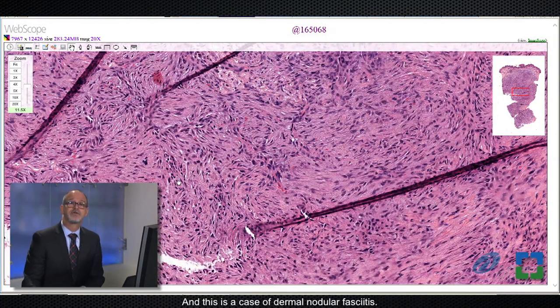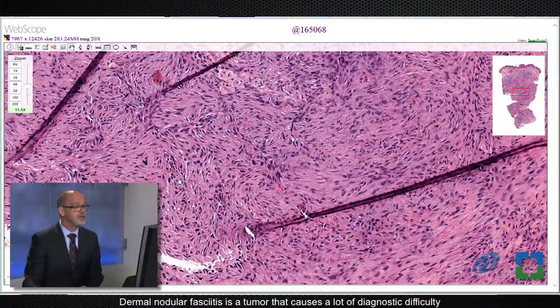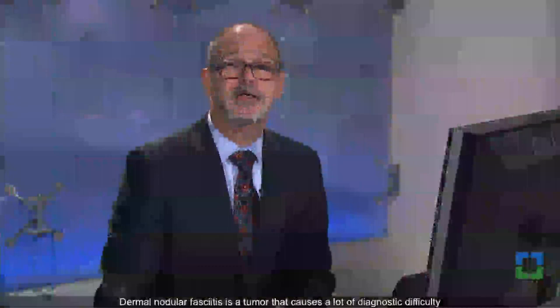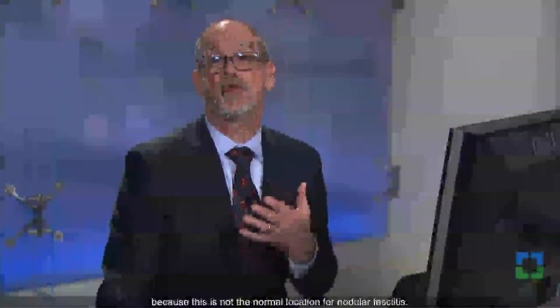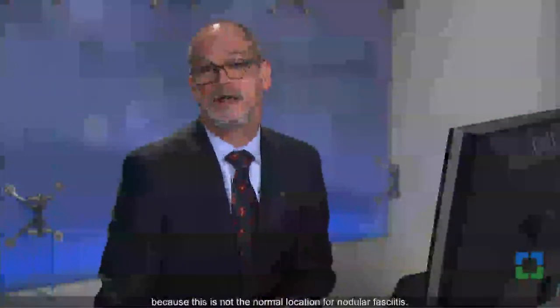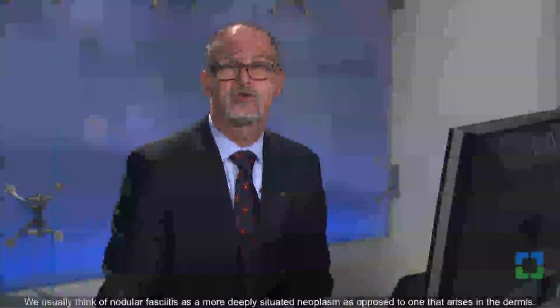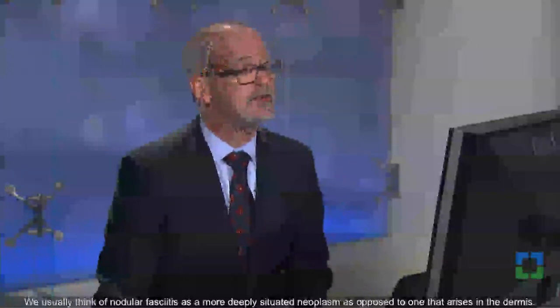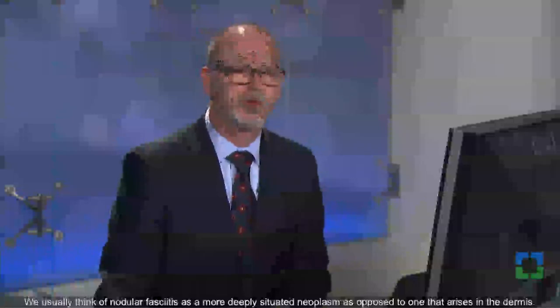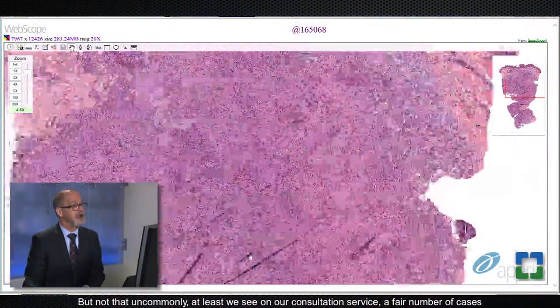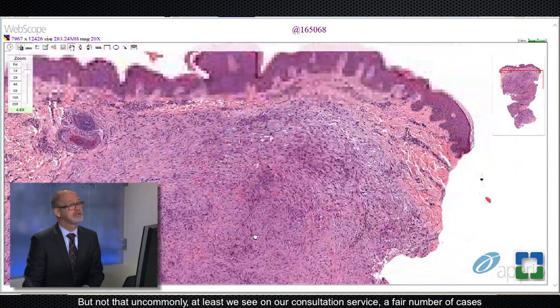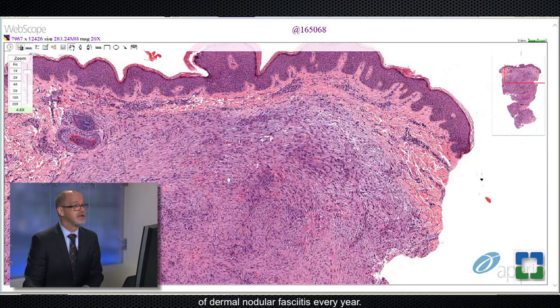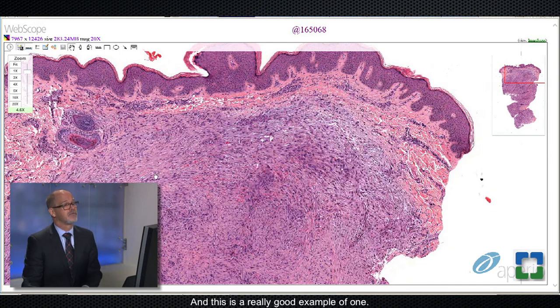This is a case of dermal nodular fasciitis. Dermal nodular fasciitis is a tumor that causes a lot of diagnostic difficulty because this is not the normal location for nodular fasciitis. We usually think of nodular fasciitis as a more deeply situated neoplasm, as opposed to one that arises in the dermis. But not uncommonly, at least on our consultation service, we see a fair number of cases of dermal nodular fasciitis every year, and this is a really good example of one.